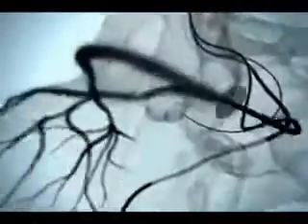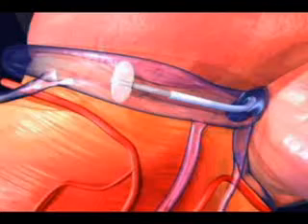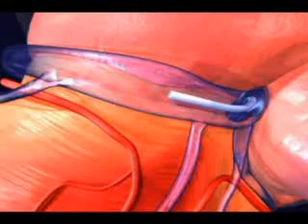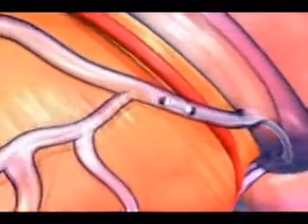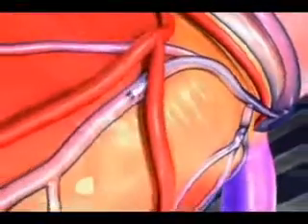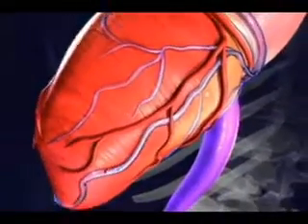After the proper location is chosen, a left ventricular lead is placed through that catheter wire, which is a small tube allowing positioning of the lead, and inserted into the target vein. The image here shows the lead being introduced into the distal, or the furthest, part of the vein that provides the best therapy.